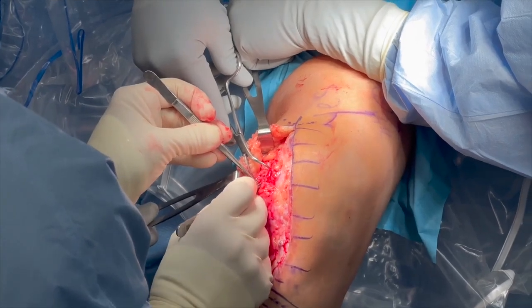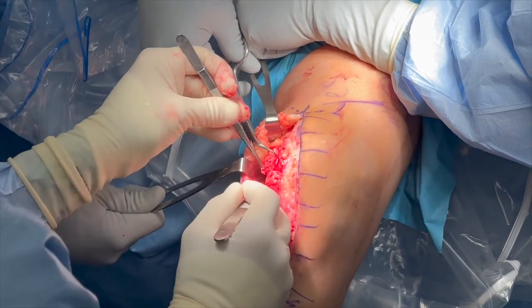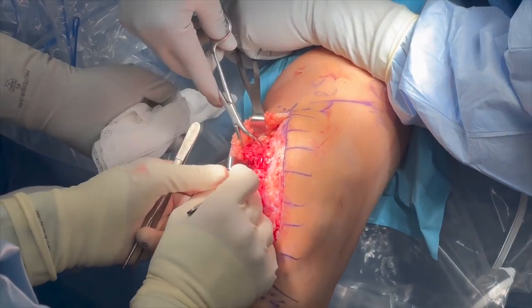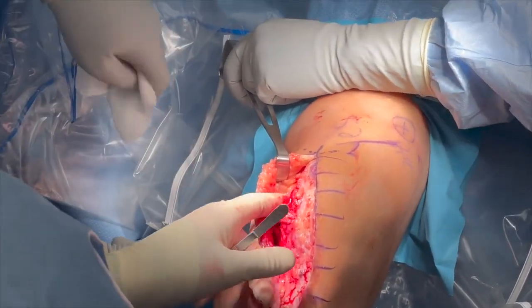The MCL graft as well as the heterotopic bone are identified. Using a scalpel, osteotome, and rongeur, the heterotopic bone is carefully removed. The knee is cycled periodically to determine the patient's range of motion and to visualize any lesions that are still blocking motion.